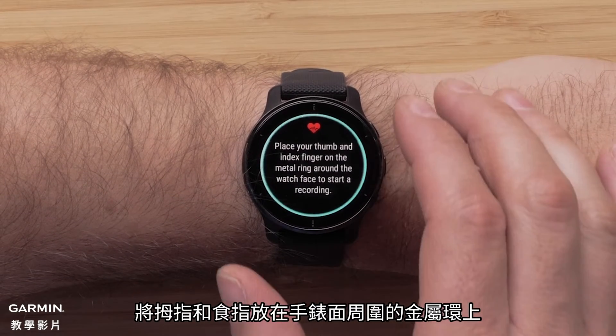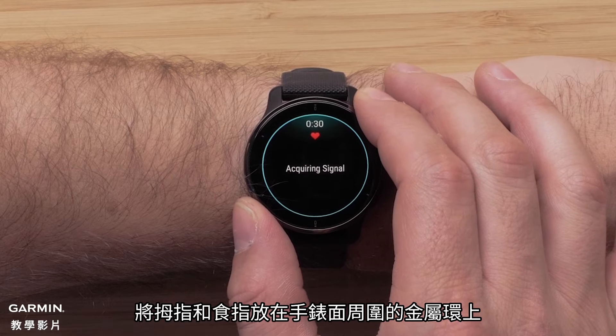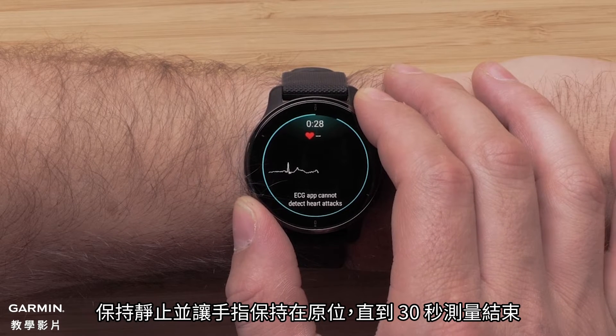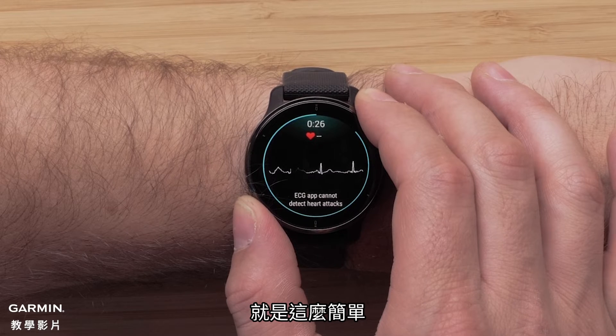Place your thumb and index finger on the metal ring around the watch face. Remain still and keep your fingers in place for the entire 30-second recording. It's as simple as that.